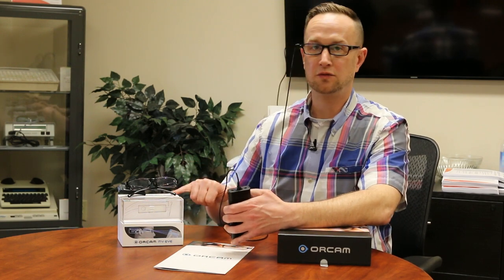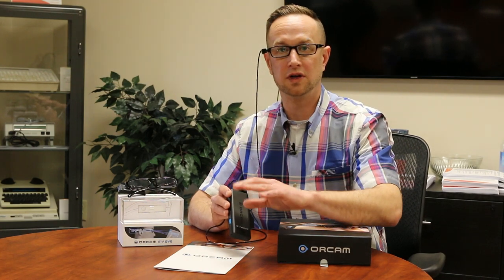The primary function of the OrCam is reading. There are three different versions: the MyReader, the MyEye 1.5 — which is what I have here — and the MyEye 2.0. The MyReader essentially just does reading; that is where its functionality stops.